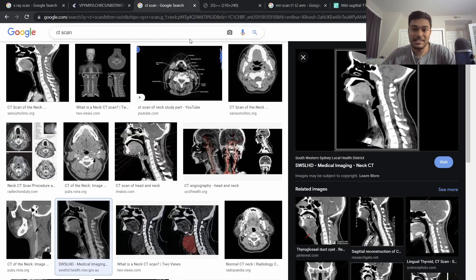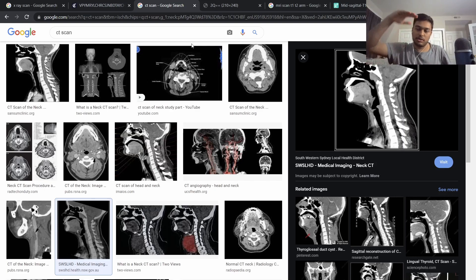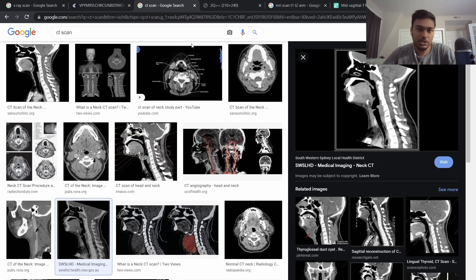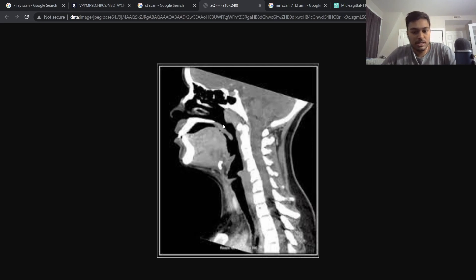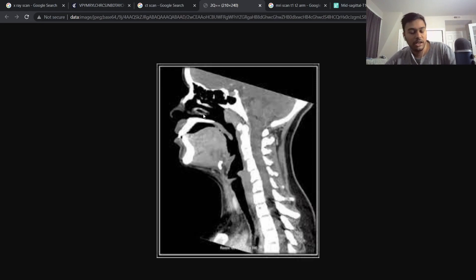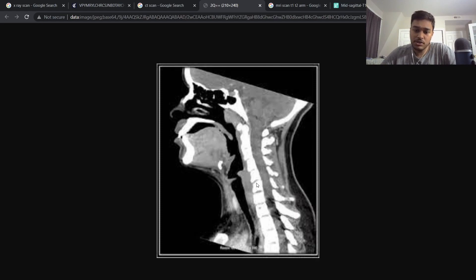The next is a CT scan. A CT scan is actually a type of x-ray imaging, but instead of having just one x-ray beam going down, you have a circle of them, which allows you to produce a 3D image using x-rays. Blowing up this picture, you can immediately tell there is a vast difference from the x-ray. You can see the bones, a vertebra, the nasopharynx cavity, the cranium, and the different air passages in the head.